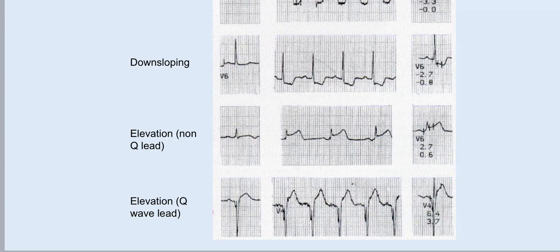If the patient already has a Q wave and you exercise him and ST segment elevation appears at the Q waves, that doesn't mean a lot. Okay, it does not mean ischemia. It means ischemia only if you induce ST segment elevation in leads without Q waves.